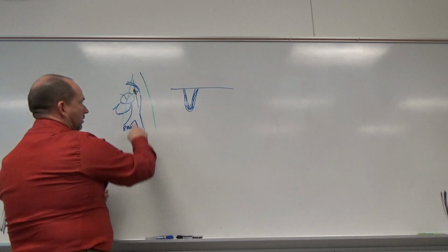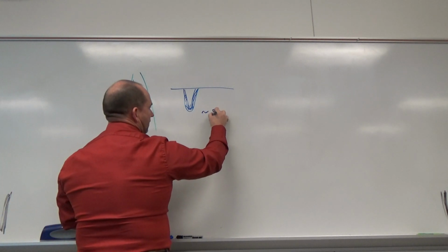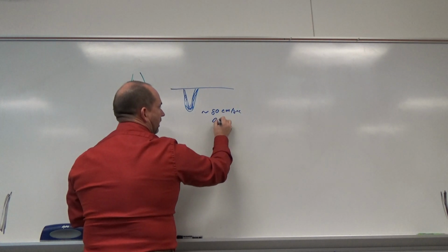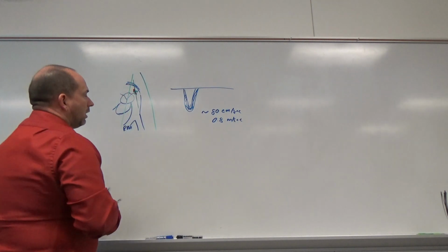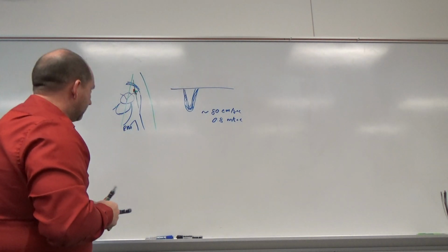Its velocity is going to be a little bit less than through the valve itself. We should be up around roughly 80 centimeters per second or 0.8 meters per second, depending on your system settings. Okay, so baseline up, this should take the majority of the height of that wave.